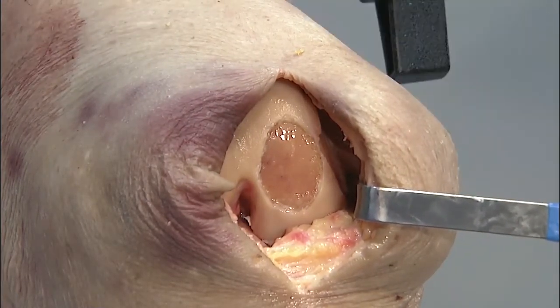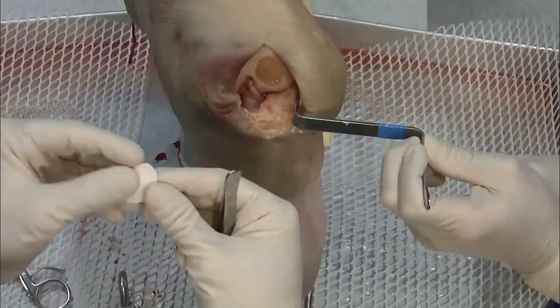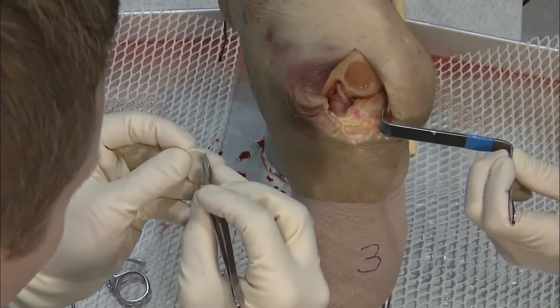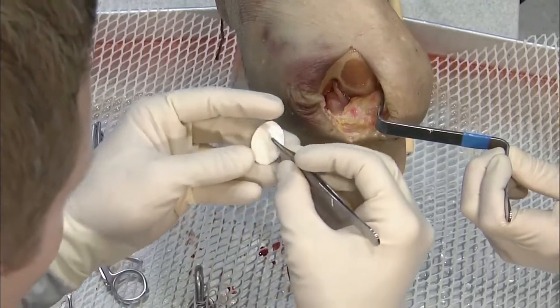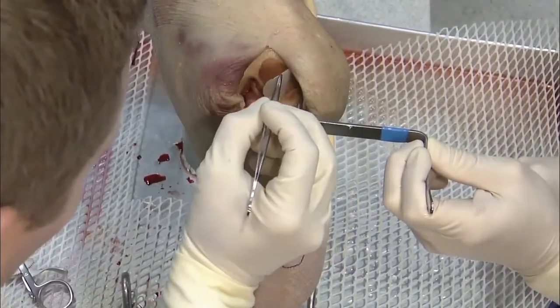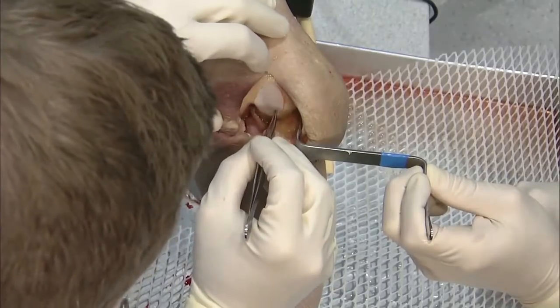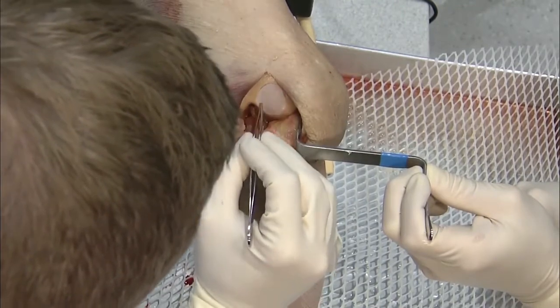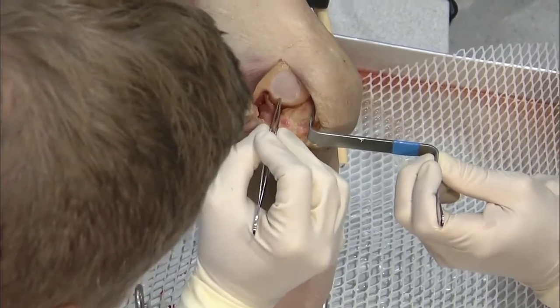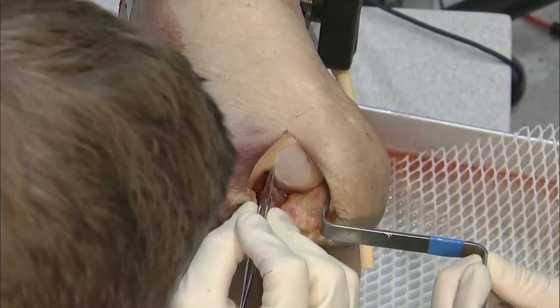And then now we have our implant. And remember, the rough side was up, so what we're going to do is flip it. If I can just get this out here. I find that a joker works well in surgery. Then you just want to make sure you flip it. So this is fitting really nicely. You see it just a little bit coming up the wall, which is fine.